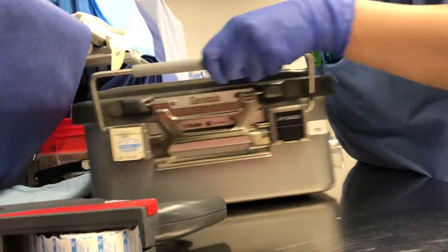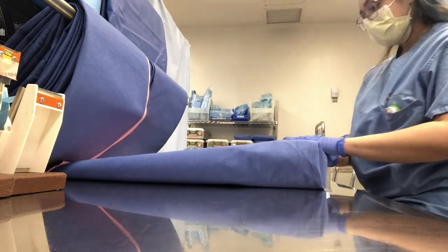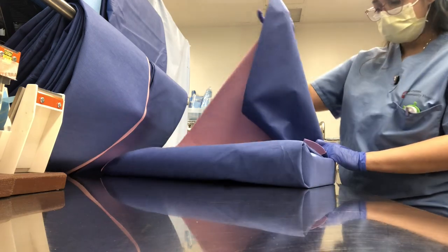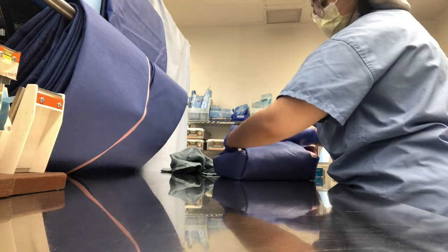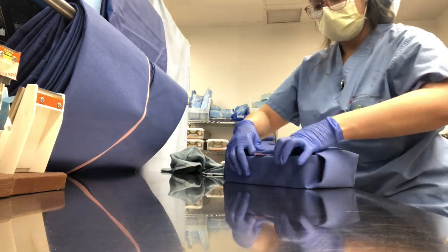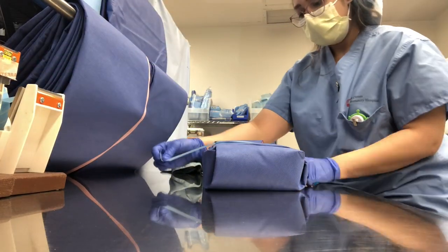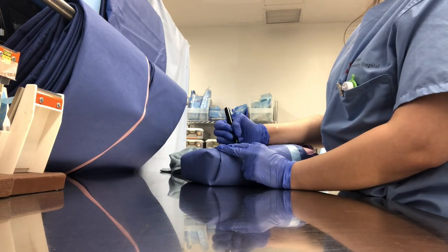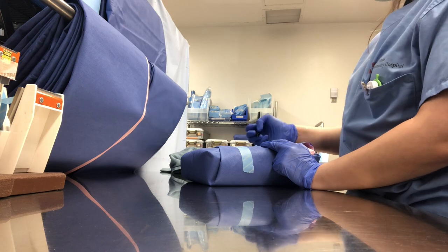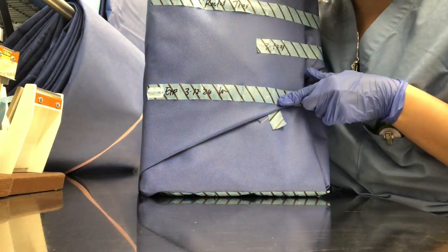Not only do we have trays for sterilization, but we also wrap some instruments. Here I'm wrapping an instrument tray that doesn't have an outer container — just making sure it's tight, nice, and neat. Now I'm adding the chemical indicating tape. This tape has white lines when it's not sterile; when sterile, the lines turn black. I'm adding the name of the tray, who assembled it, and the date it was run. Here's a non-sterile tray that hasn't been run through the sterilizer, and here's a sterile tray that has been processed.